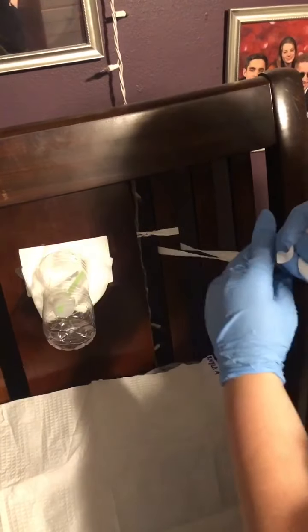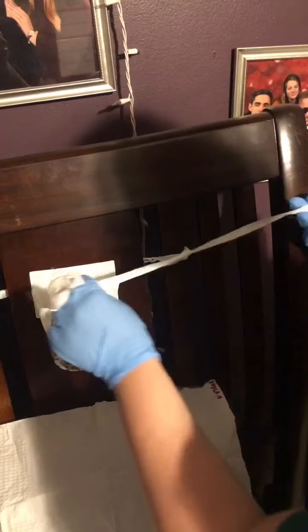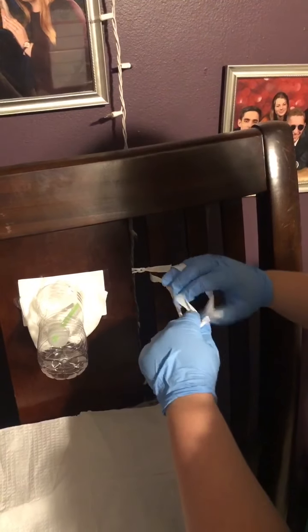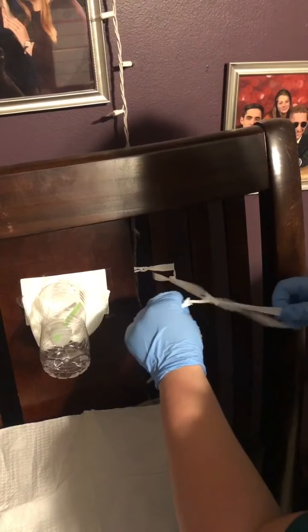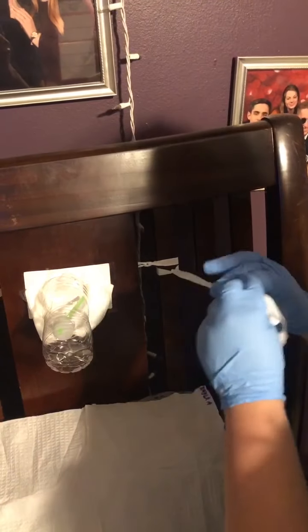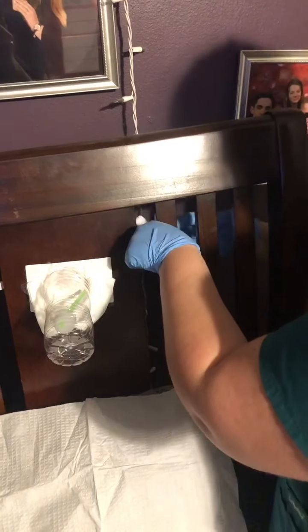So if this was a faceplate, I would be tying it into there. Double knotting, but making sure that it's not too tight, that I can at least fit 1 to 2 fingers underneath of there, but that it's also secure enough, keeping 6 inches longer.